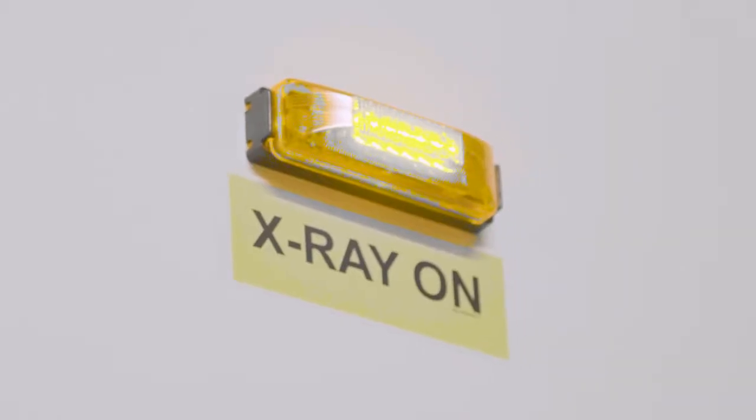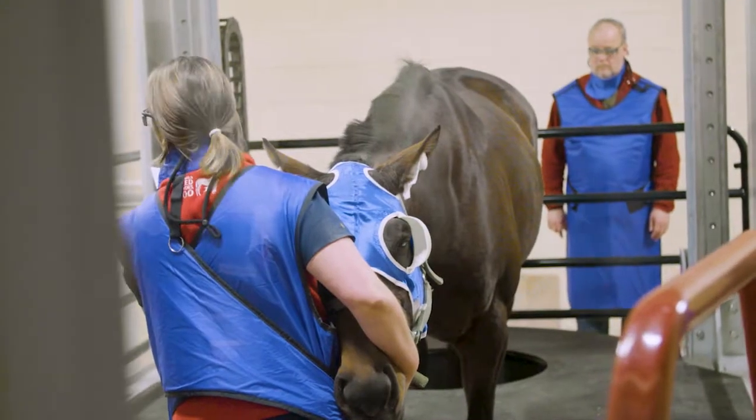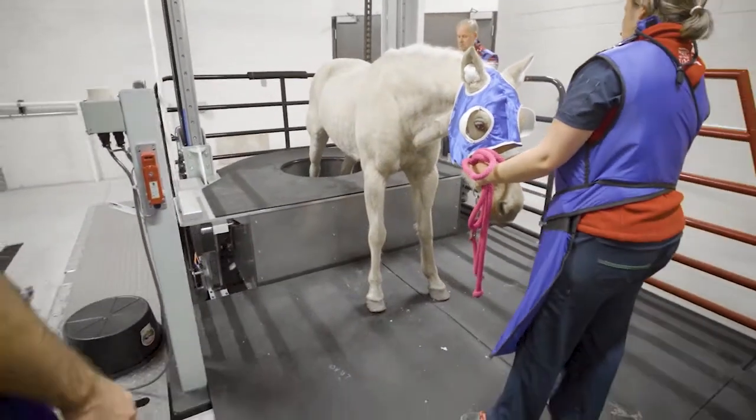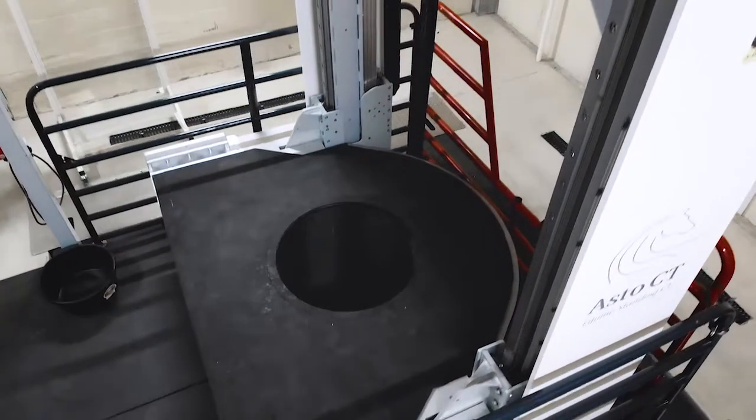We've been waiting a long time to go from CT under general anesthesia to CT standing. The big advantage of the CT is the quality of the imagery for orthopedic conditions, whether it's soft tissue or hard tissue. This is a substantial improvement and efficiency over their current technique. This is not a repurposed human scanner — it's been designed with horses in mind.